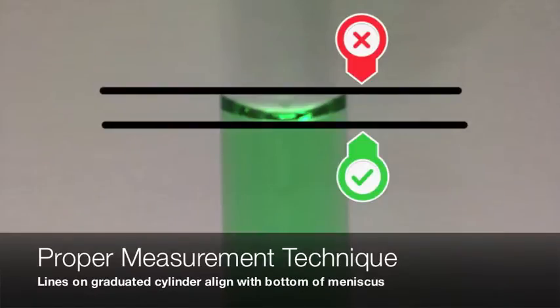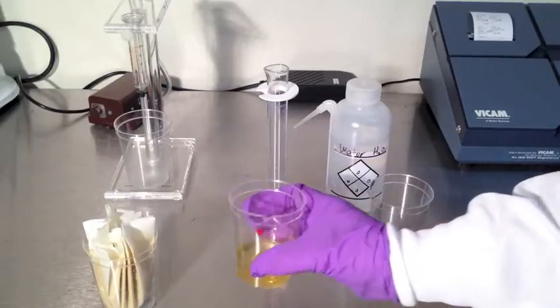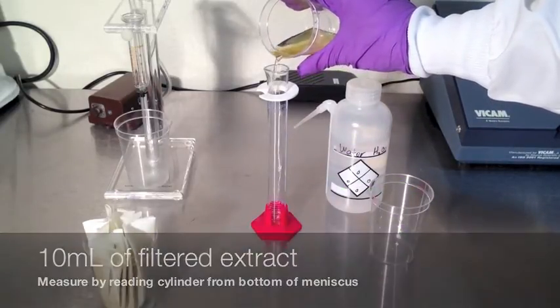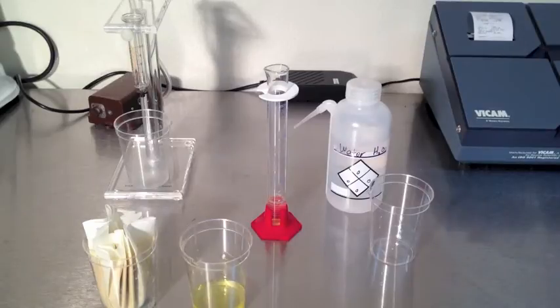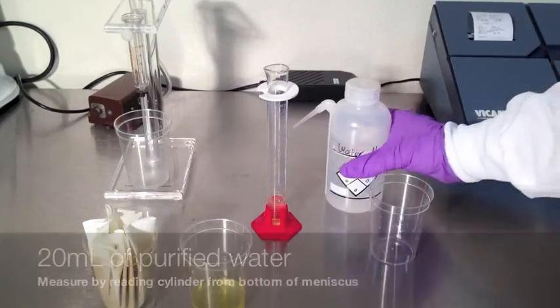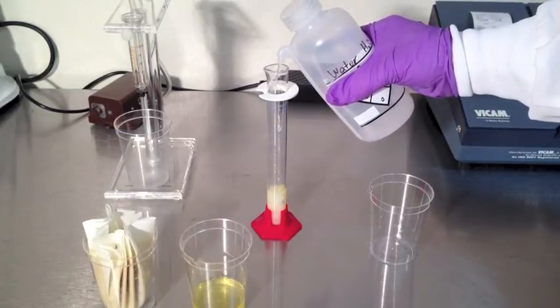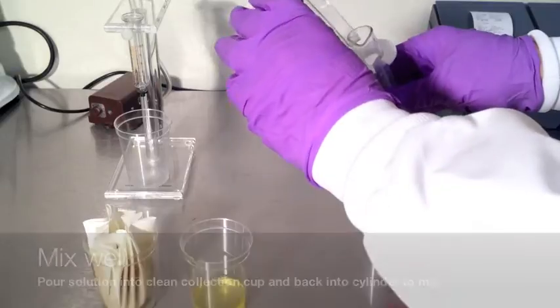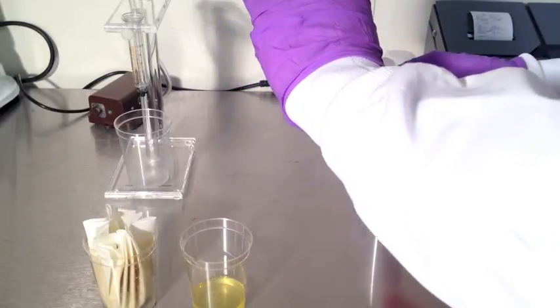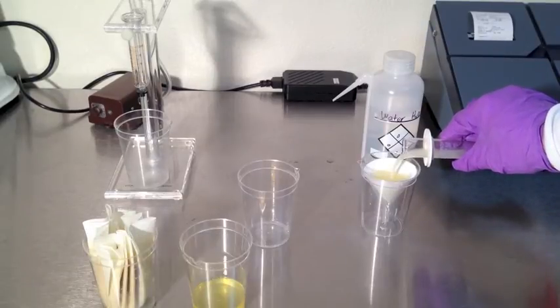When measuring with the graduated cylinder, always align with the bottom of the meniscus of the water. To dilute, combine 10 milliliters of filtered sample extract with 20 milliliters of purified water. Mix the diluted extract by pouring back and forth into a clean collection cup. Filter using the microfiber filter, pouring directly through the filter into another clean collection cup.